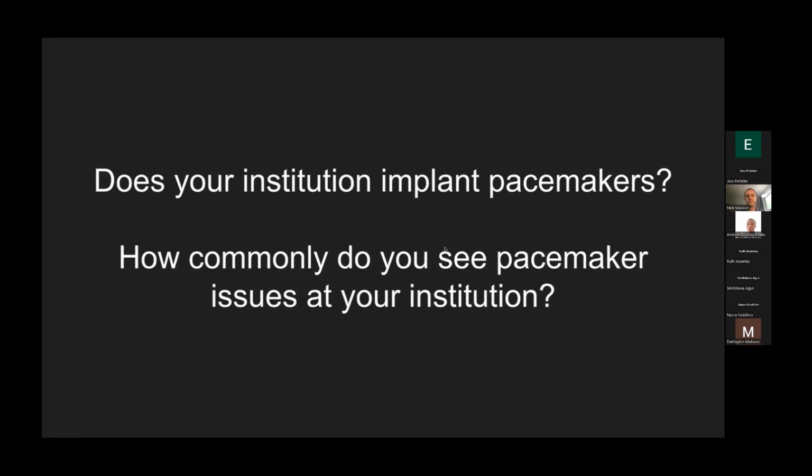And then for transcutaneous pacing, there's not as many contraindications, but we do need to think about whether it's going to work or not. If someone has a lot of chest wall hair, definitely need to shave that off before you try to transcutaneously pace them. You can't do it if someone's chest is wet, because the wetness is going to cause danger to people around them. You don't want to have the water falling on the bed and then a staff member touching the bed and getting shocked and things like that.